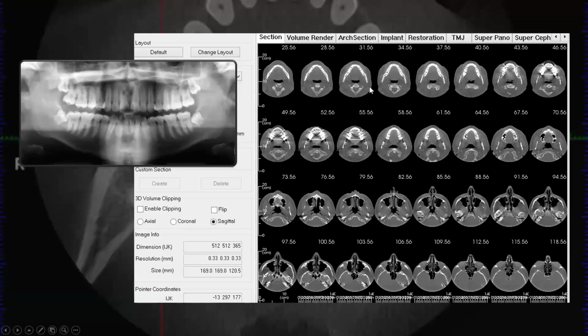But instead of looking at one single image, as I said, you can't see every voxel looking at any one image in a cone beam CT. So one of my rules of thumb is think of it like a movie rather than a snapshot. You've got to be scrolling back and forth through these different slices. As you can see, there are hundreds of individual axial slices. And there are some things I like to look at more in the coronal view or the sagittal view. And so you've got to scroll through all several hundred of these, however many they happen to be.